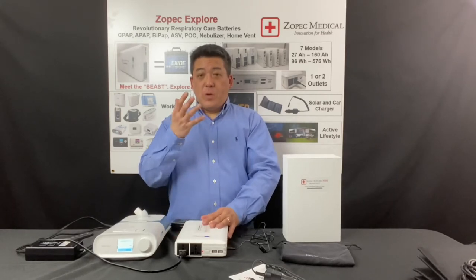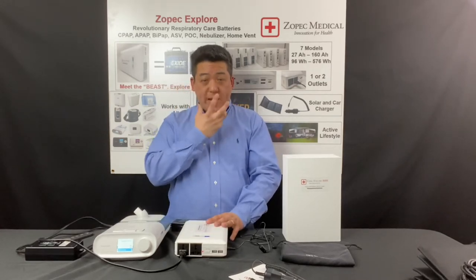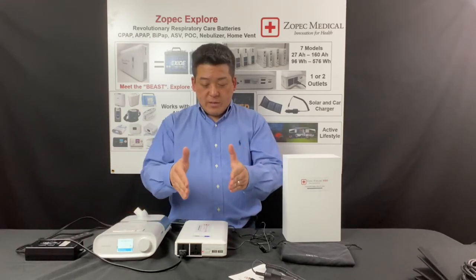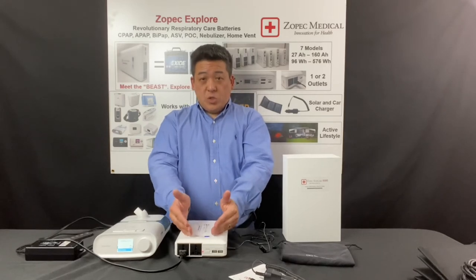The next thing is to check if the UPS setup is correct and working properly. Just wear your mask and start your therapy. Make sure that you look at the capacity counter and it stays at FF 100% — it shouldn't drain.